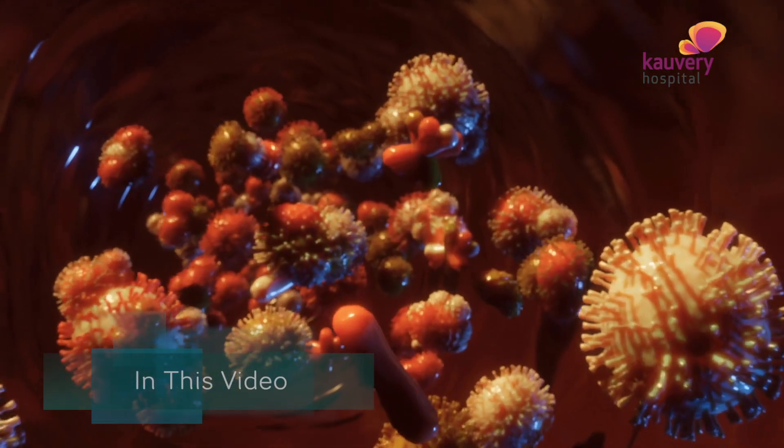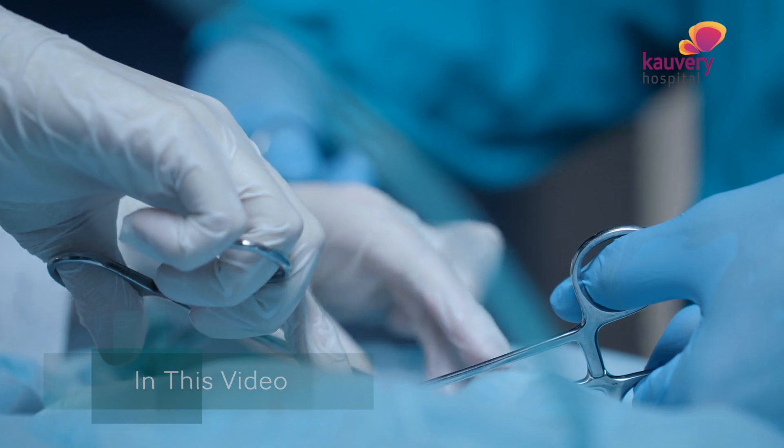If you look at this, what is the advantage of this? You can use it to remove cancer tissue.